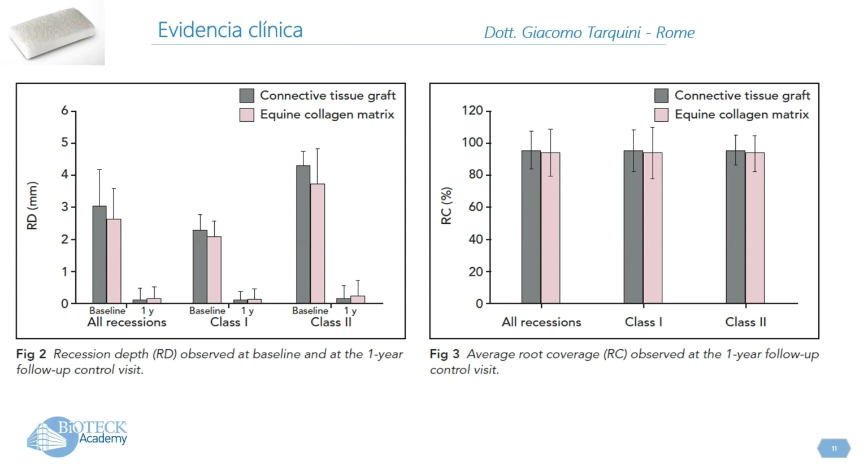And so the procedure is also faster, because there is no need of preparing the connective tissue graft to be inserted into the point of recession.